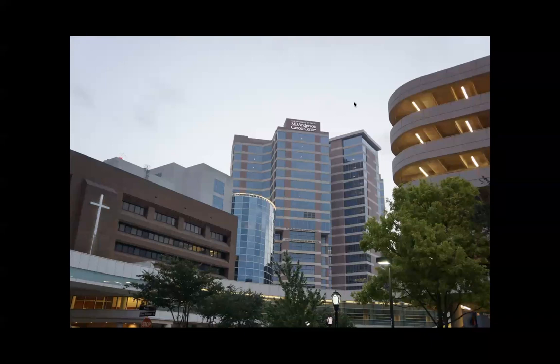I have a very short comment, if possible, Professor Raju. Please. This is a very nice illustration of a sessile serrated adenoma, which can be commonly found at colonoscopy. As we know, sessile serrated adenomas are most often sporadic, but they can be part of the serrated polyposis syndrome. Because in this case the bowel preparation was suboptimal and there were some lesions left in place, this raises the question: is this definitely not a serrated polyposis syndrome?